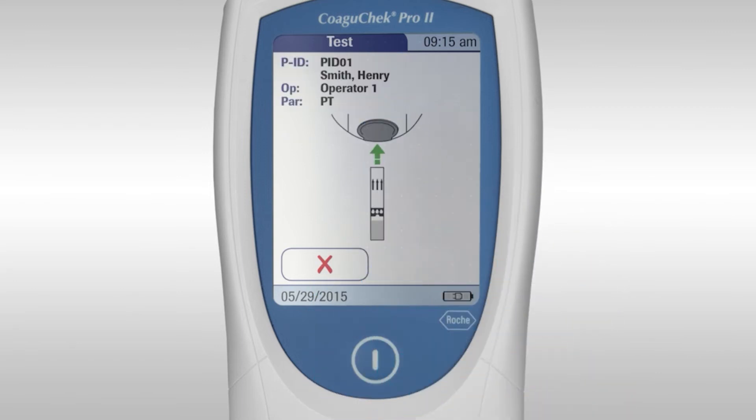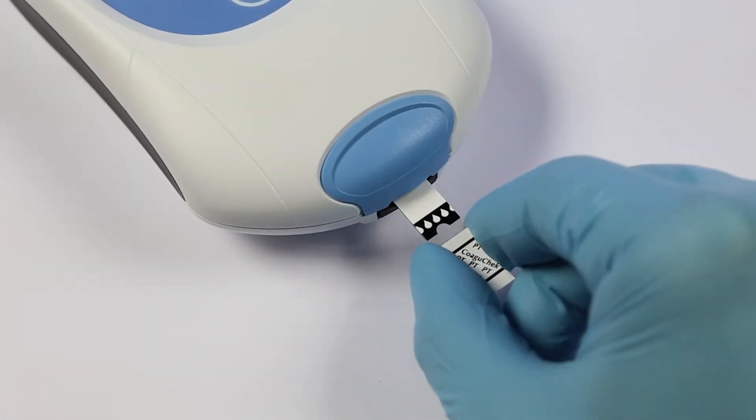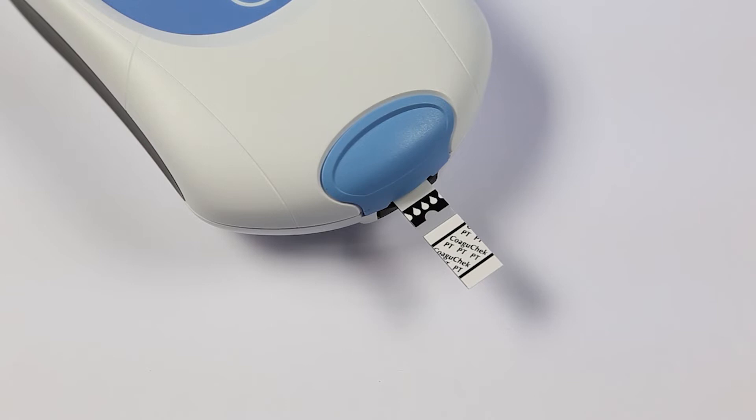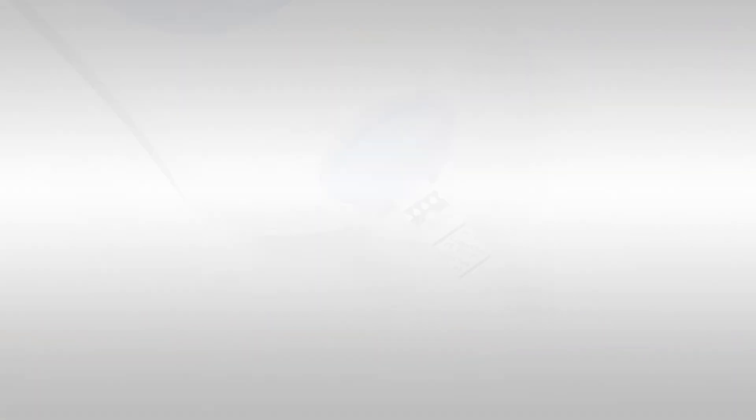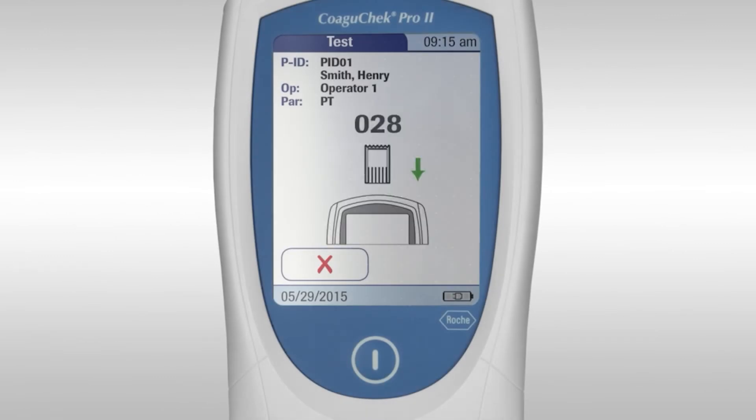Only insert the strip when the meter prompts you. Remove a strip from the pot and replace the lid immediately. Only handle strips with clean dry hands. It is recommended to wear gloves whenever you perform a test. Insert the strip in the direction of the arrows. If the meter has not previously seen the lot number of strips, you will be asked to insert the code chip that comes with the pot of strips.